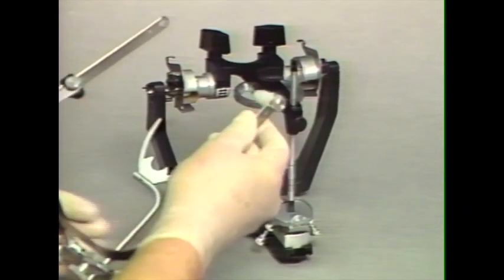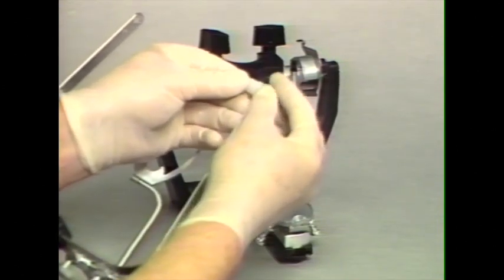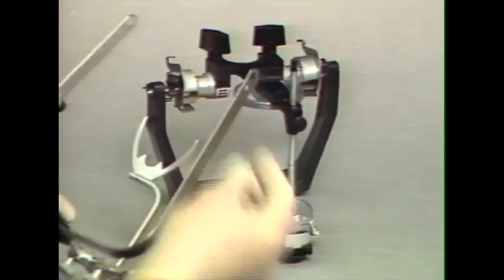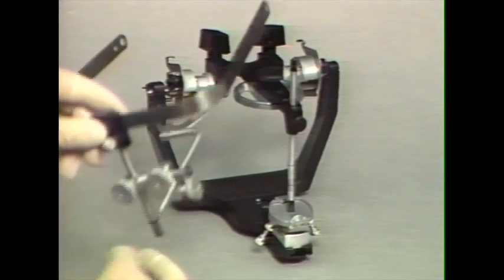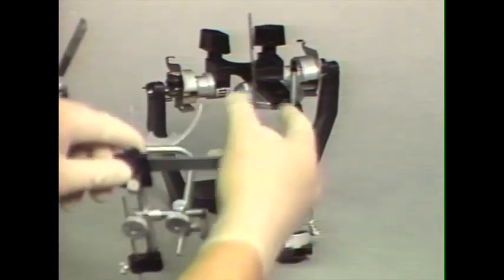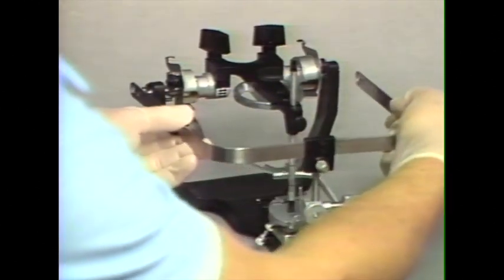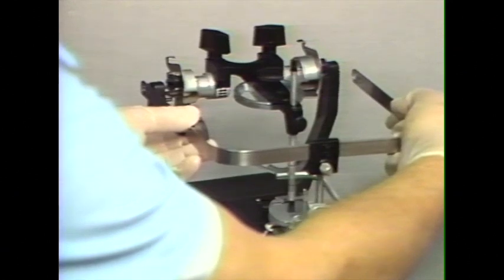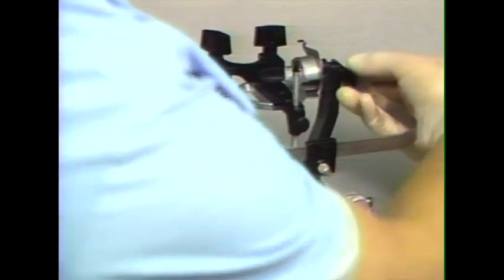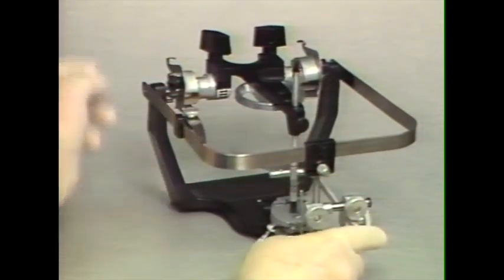To use the direct mounting, we need to remove the ear rod and attach an anterior elevating device onto the anterior vertical rod, and then spring the Facebow apart and place it onto the condylar axis of the articulator. It snaps into the second hole on the side arm of the Facebow.